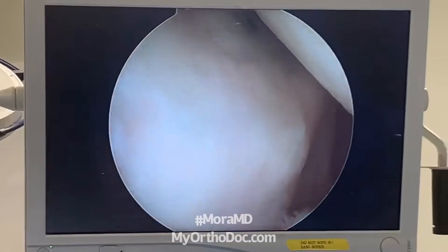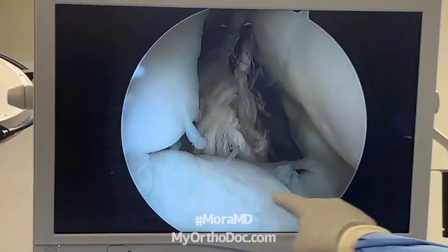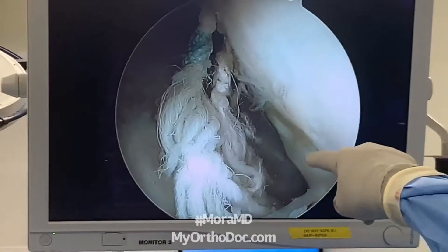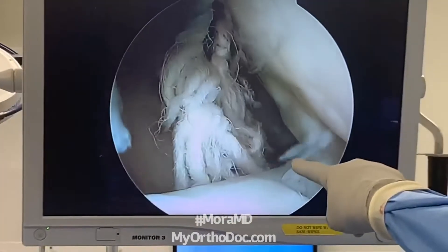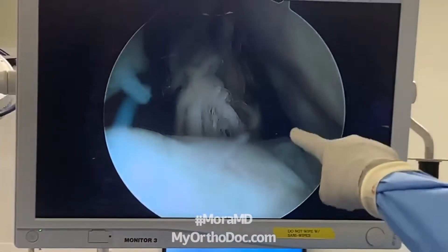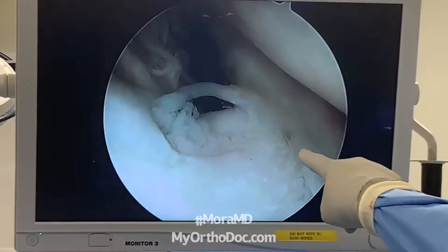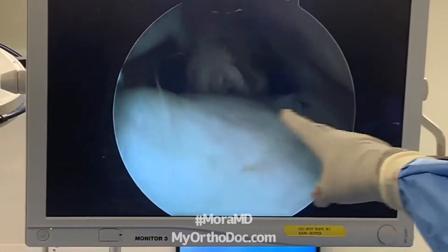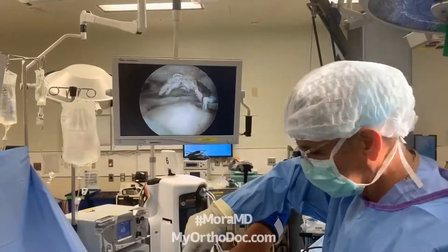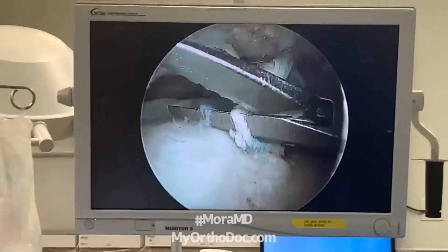Then I move like this and look up at the rotator cuff. The rotator cuff is right there and you can see there's a tear, and the old sutures. This is a really interesting view because you can actually see the old sutures right there — the knots are right there. So you can see the knots did not pull out of the bone. What happens is the tendon gets ripped away from the sutures, which ends up compromising the edge of the rotator cuff.